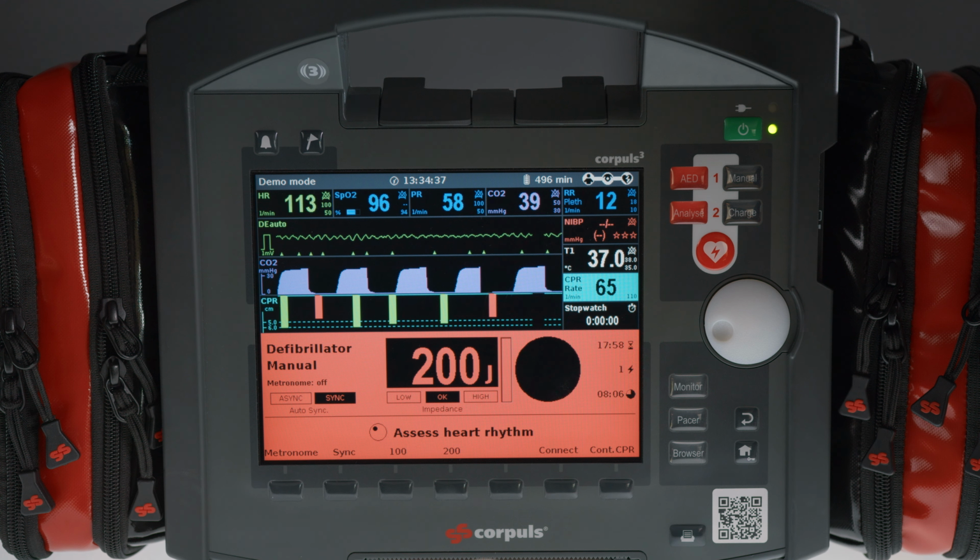For the CPR feedback sensor, the designation for the display of the 2 pressure depths has changed. You can now choose between the standard pressure depth and the reduced pressure depth.